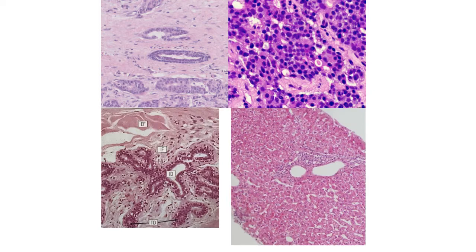Firstly, we look at abnormal liver biopsy. There are no normal liver cells seen, such as hepatocytes, in this photomicrograph. It is mostly dysplastic glandular cells, which are hyperchromatic and pleomorphic. The variation in size between the nuclei can be clearly seen. So here we have relatively small nuclear size, and here compared to much larger nuclear size here.